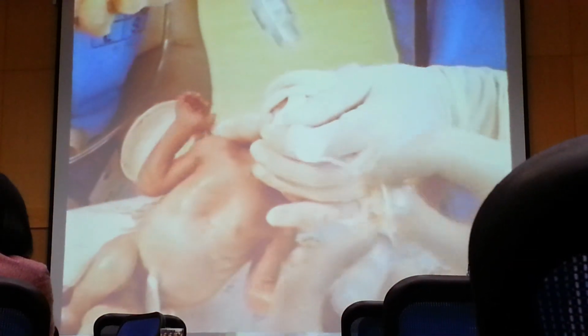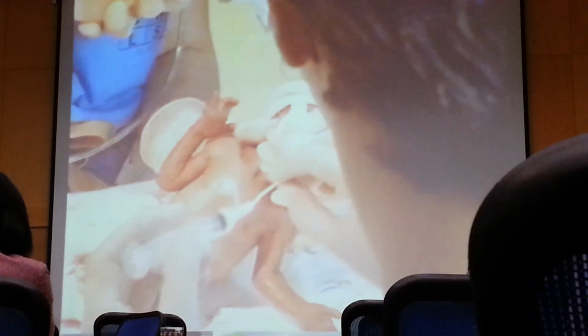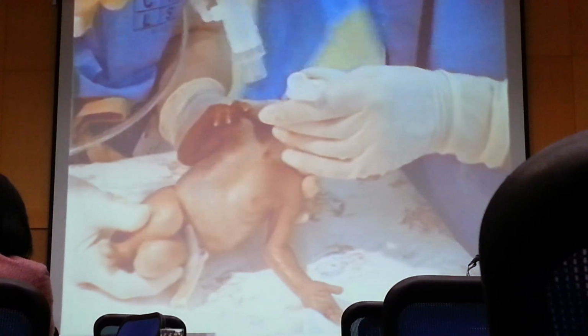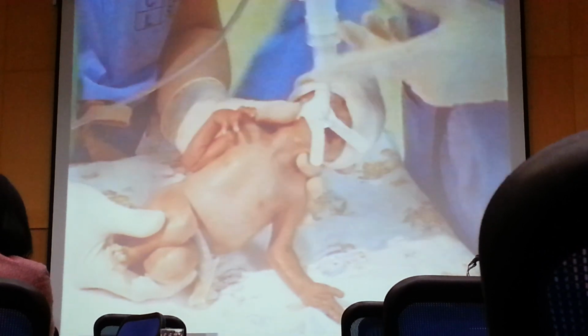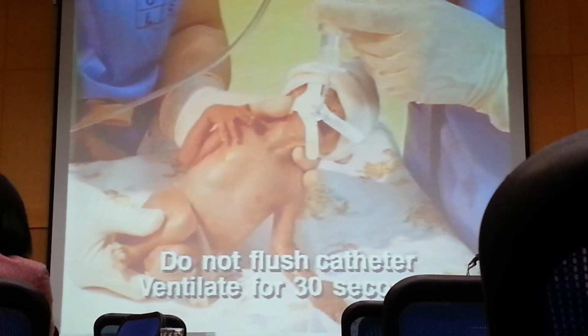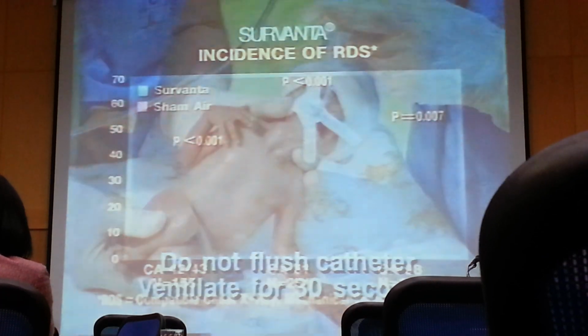Finally, rotate the infant on the cephalocaudal axis so that the head and opposite shoulder are slightly up. Deliver the 4th fractional dose and, without flushing it, remove the adapted catheter. Again, manually ventilate for 30 seconds.